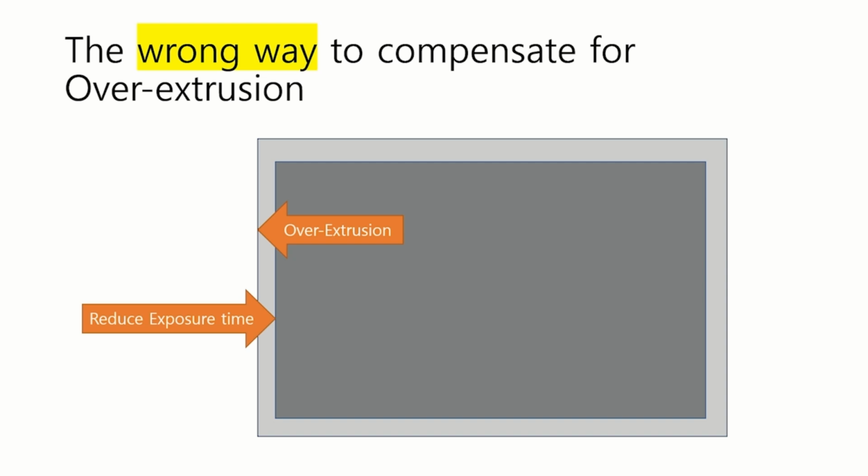Based on the results of the experiment shown, we do not recommend reducing the exposure time in 3D printing. As observed in the experiment, shorter exposure times lead to an increased failure rate in the printed structures, primarily due to insufficient curing of the resin, which weakens the strength and durability of the objects.